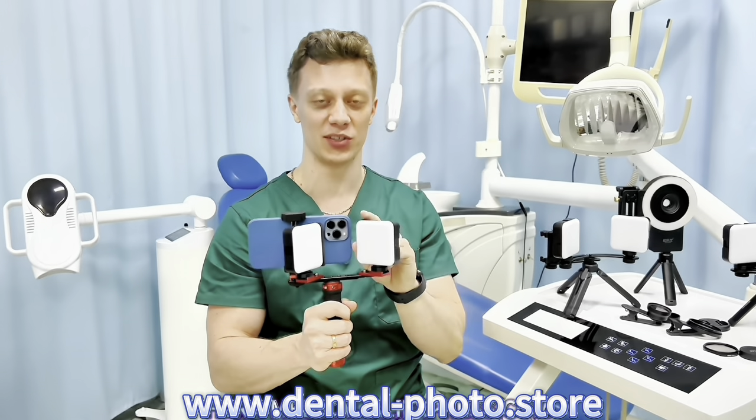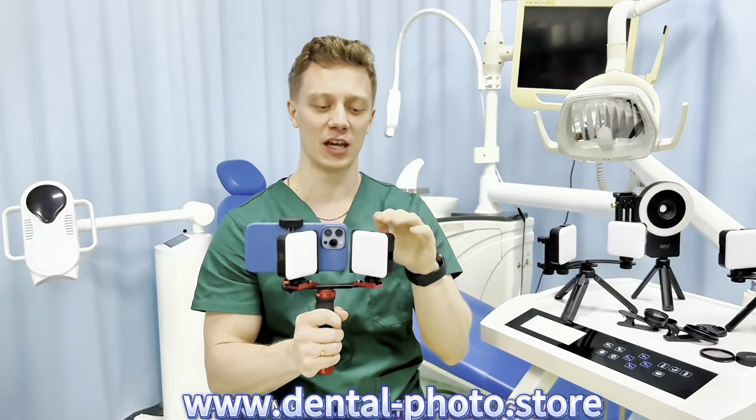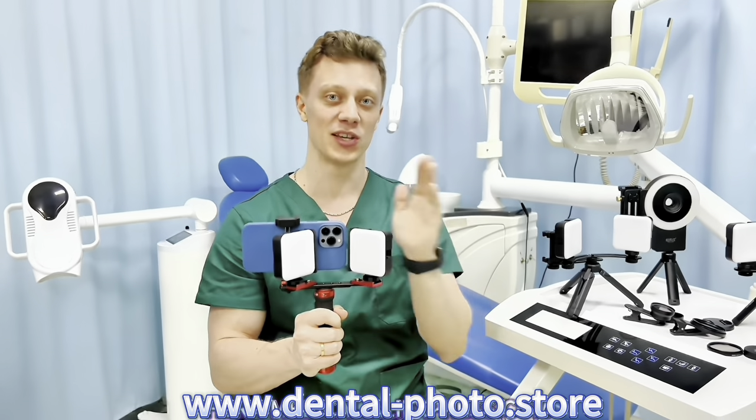We also got this upgrade — the blinds. We use them to block the light that may get from the lamp into your phone camera and cause glare on the sides of the photos. So now you don't get this problem anymore.